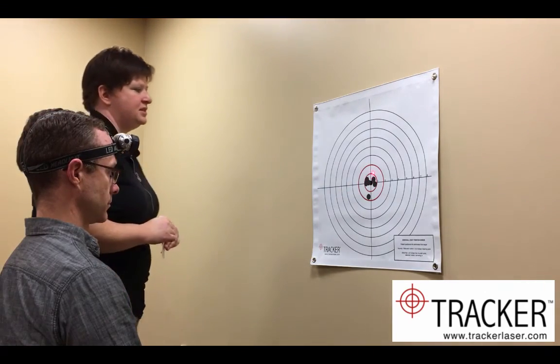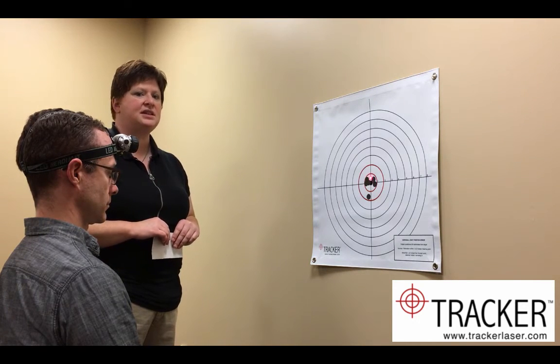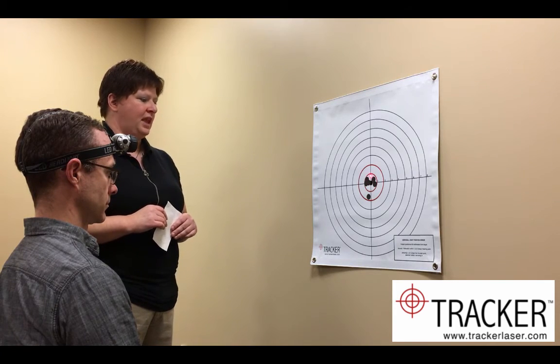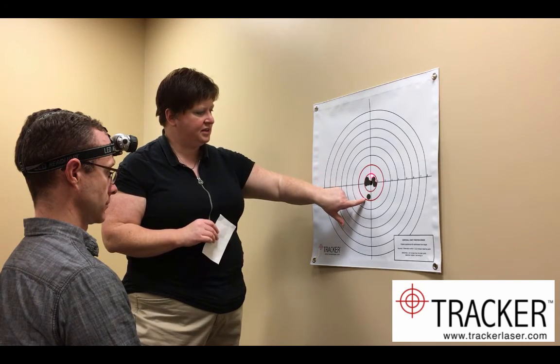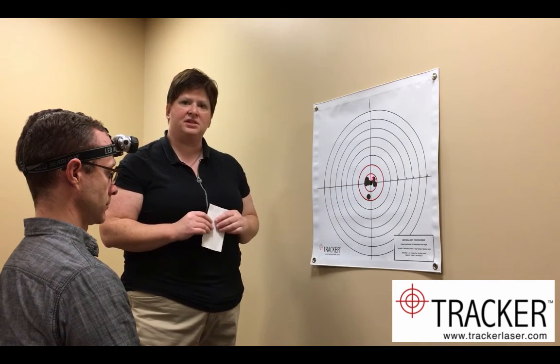You can repeat this to the right, with flexion and extension—at least six trials in each direction. If the dots are consistently outside of the second red circle here at two inches, that would be considered abnormal.